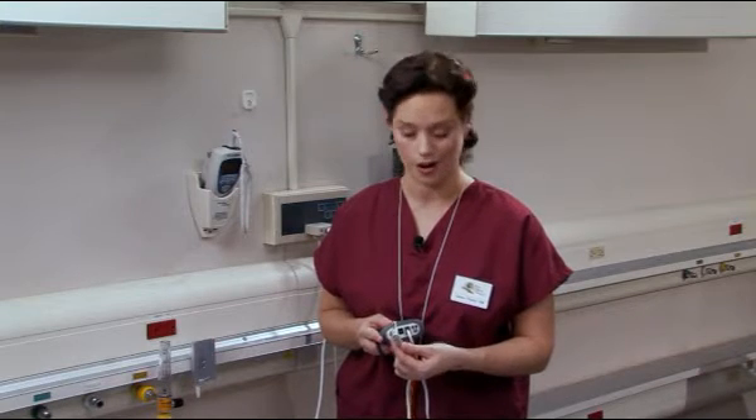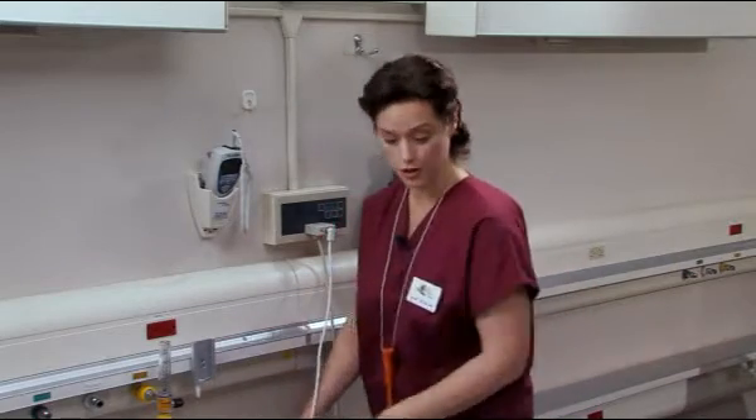Take one end of the quarter-inch phone plug on the optional nurse call interface cord and plug it into the bottom of the Informer Deluxe labeled "nurse call." Take the other end of the cord and plug it into your nurse call system.